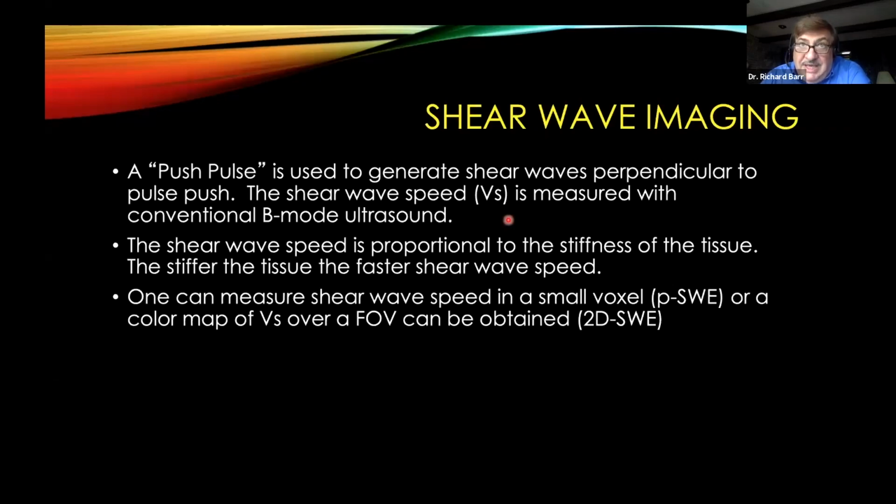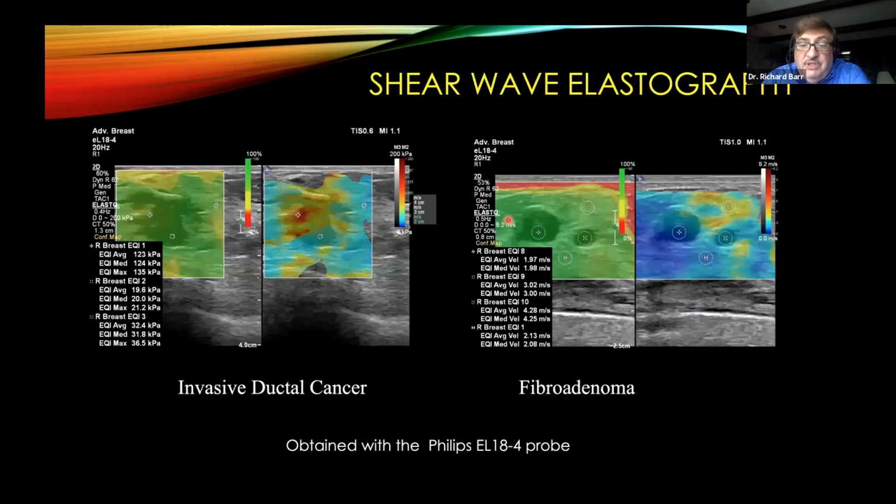However, when you're looking at cancers or focal lesions, malignant lesions are always very heterogeneous in stiffness. So you need to know where to place your ROI box to find the stiffest area to get a good interpretation. So we can't use point shear wave because we don't have that color map to tell us where the highest value is. So in breast, we're always going to use 2D shear wave, look at that color map and find the area of highest stiffness within the lesion or the surrounding 3 millimeter area.